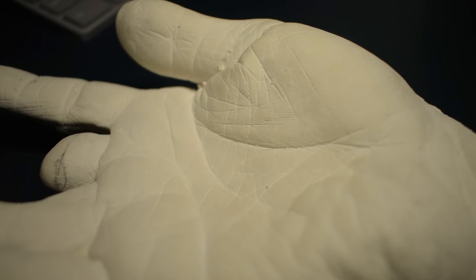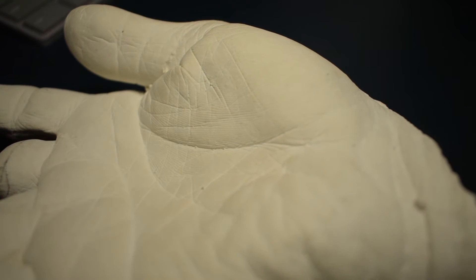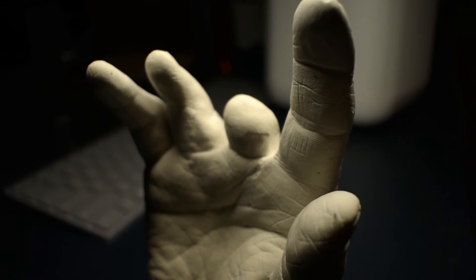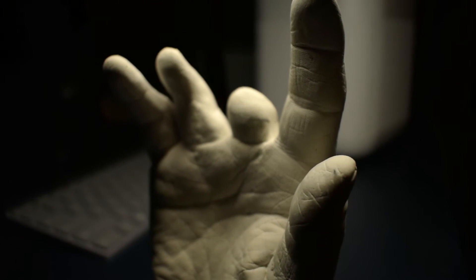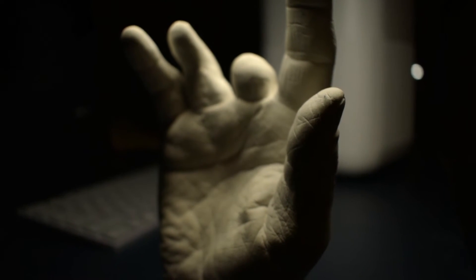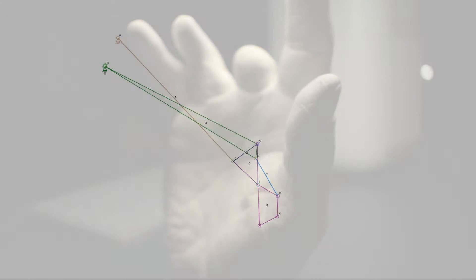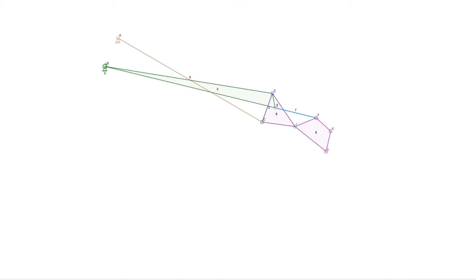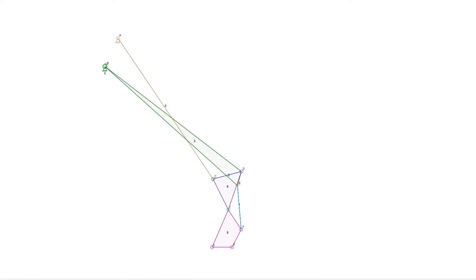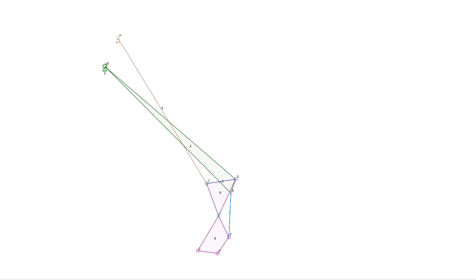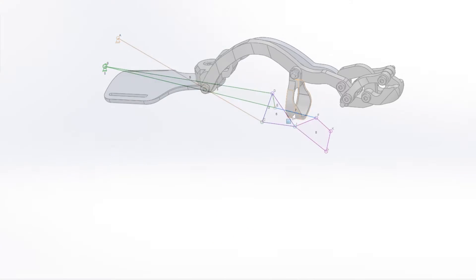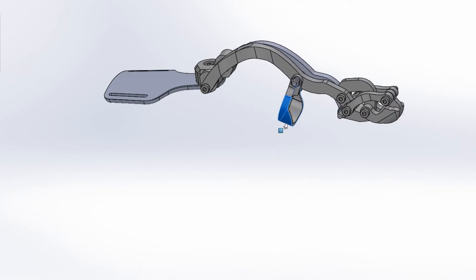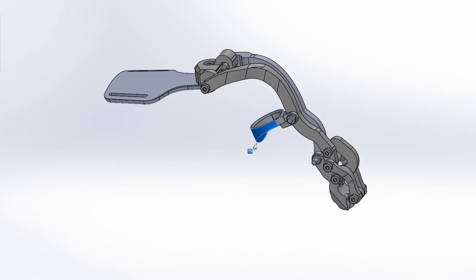To ensure a good fit, I made an alginate mold of the user's hand. The hand was cast in plaster and was used throughout multiple iterations of the design. After getting the general motion and dimension of the linkage mechanism right, I moved into SolidWorks to recreate the design using a top-down modeling approach.